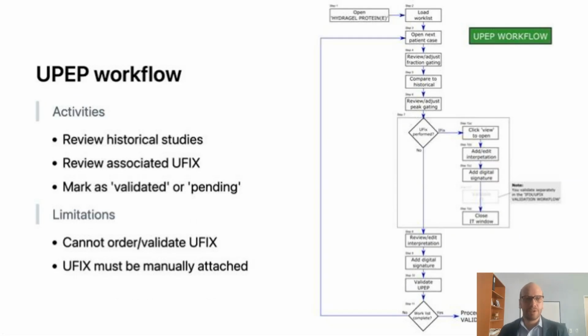All right, so I went into that first workflow in detail, so the others will move more quickly. The urine protein electrophoresis workflow looks almost identical, with the exception that we do not have immunosubtraction offered at our institution, so all reflexive immunotyping is done via immunofixation.